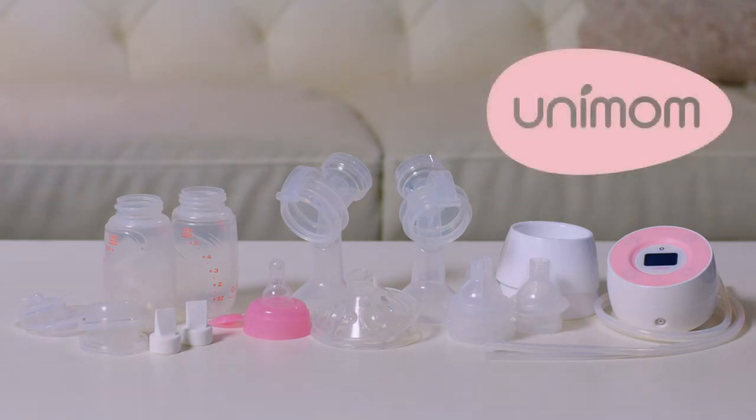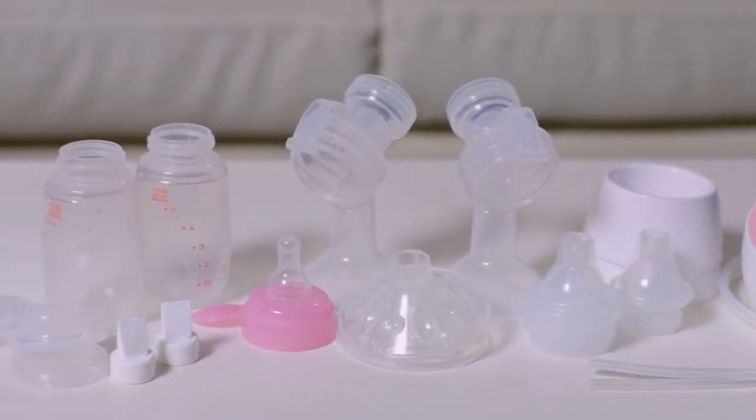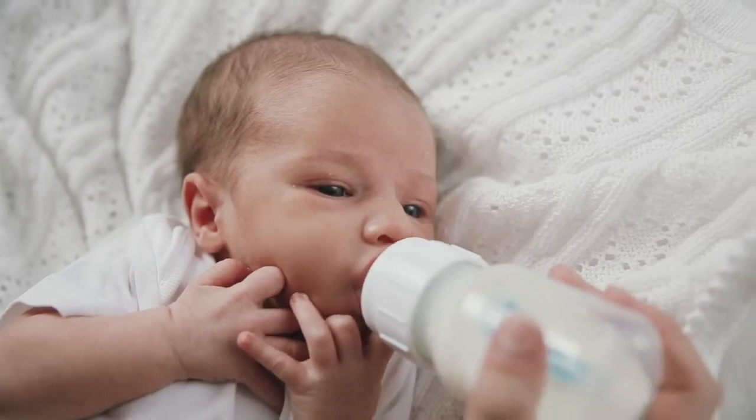The Minuet LCD is all about safe, sanitary breast pumping, which makes its cleaning and upkeep so important.